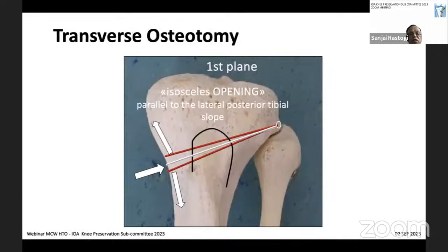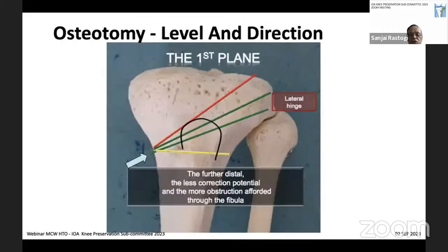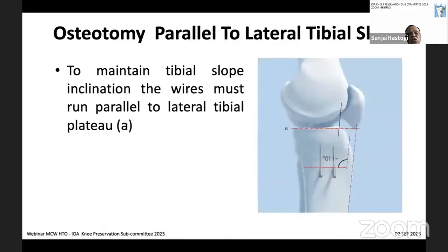The transverse osteotomy is done from the junction of the convex and concave part on the medial side of the tibia, and this is directed towards the lateral hinge. And this is the window where it should come. If it is above, then it goes into the joint, which is not correct. And if it's below, it will lead to decreased correction because the fibula is there. The osteotomy should be parallel to the lateral tibial slope. And this is how it is seen.